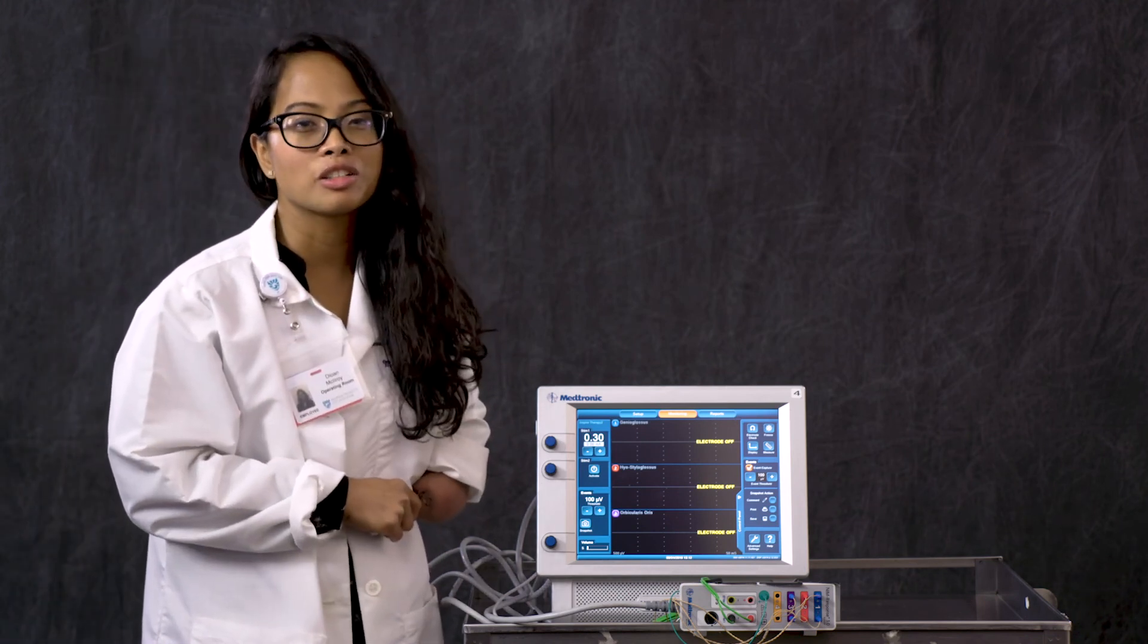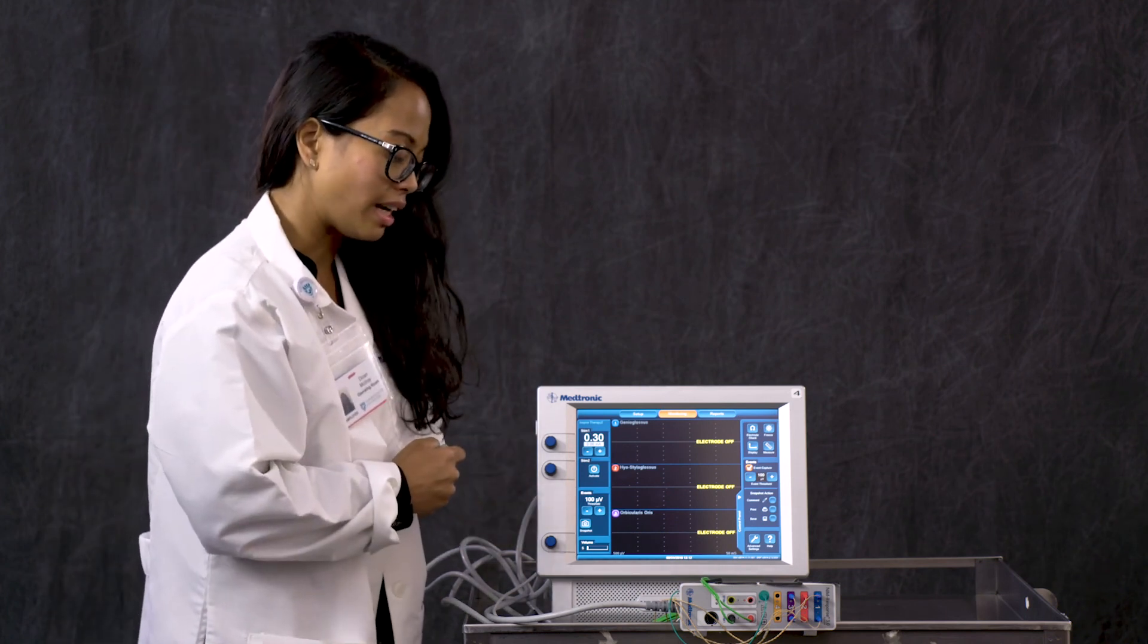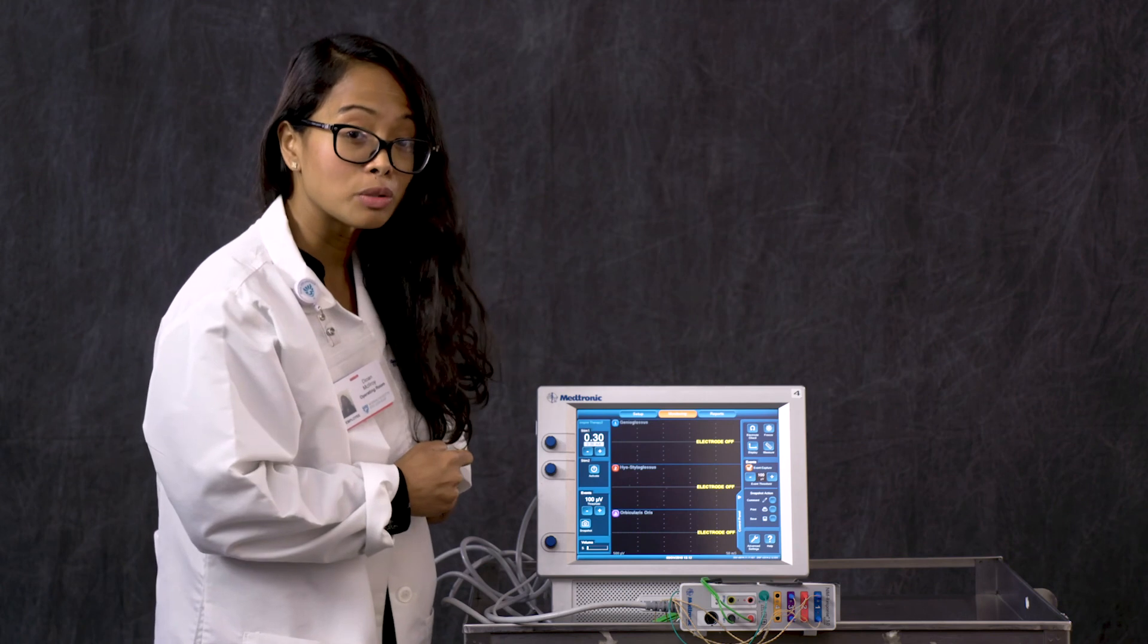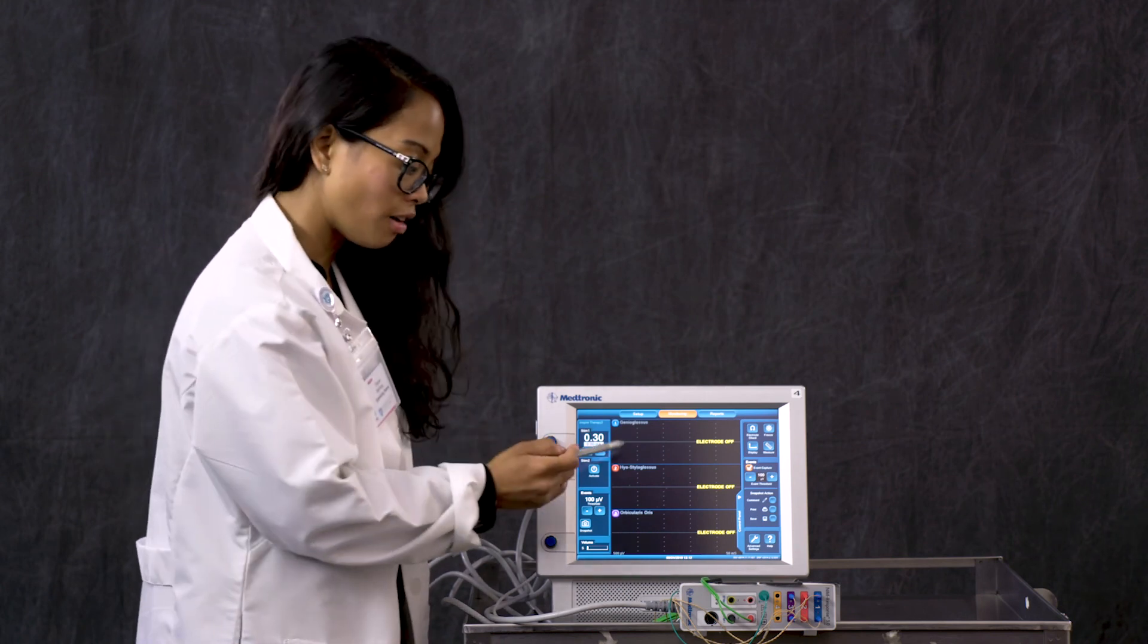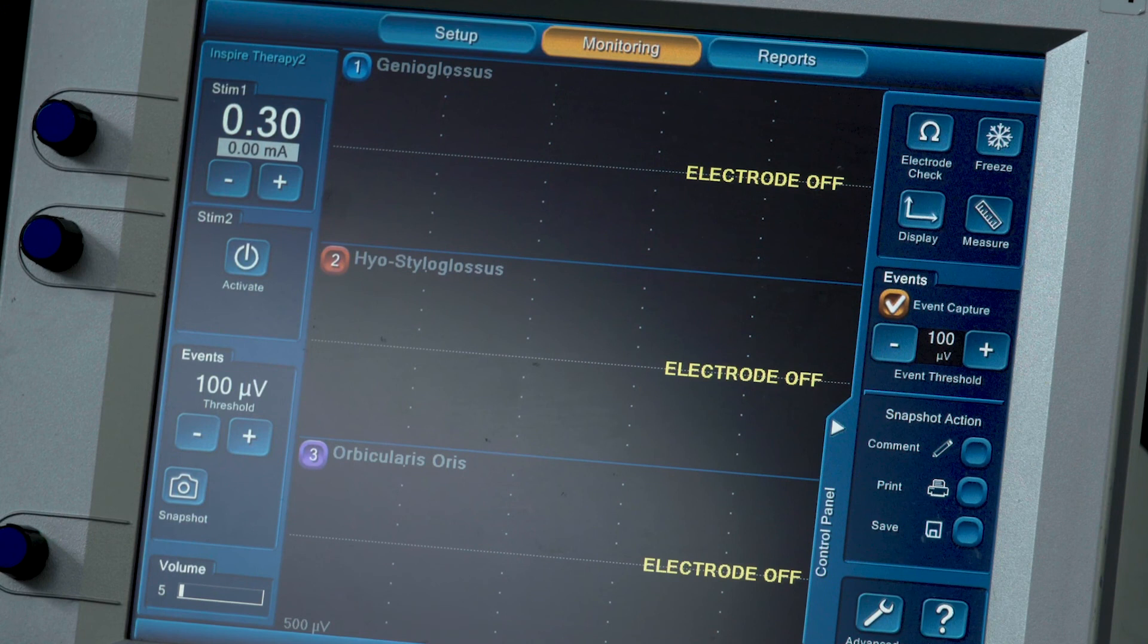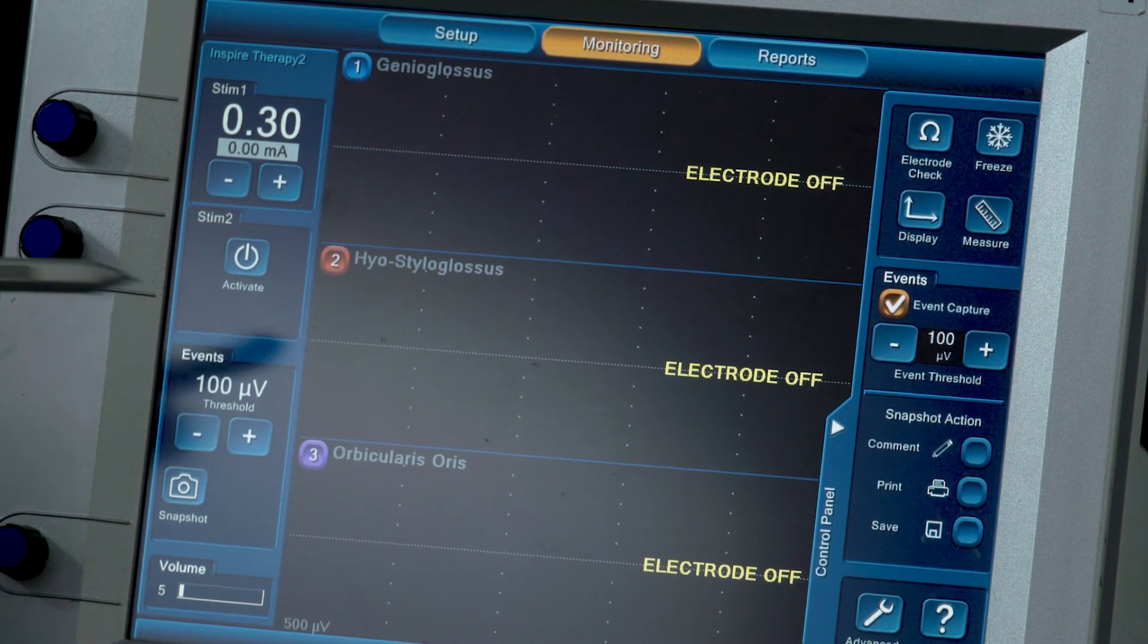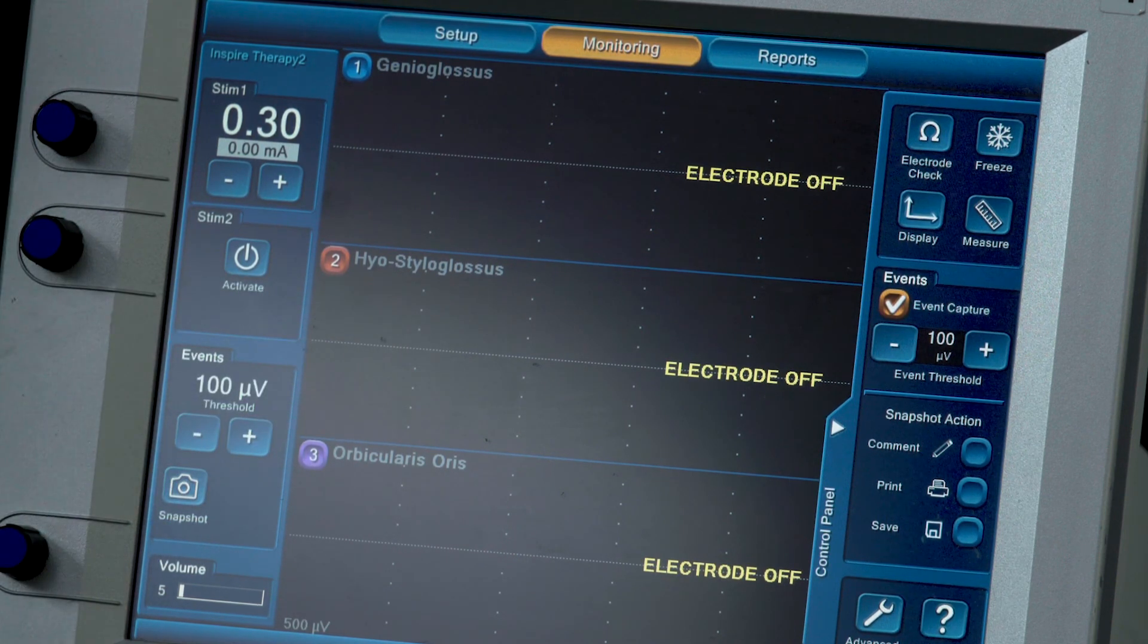So here we are on our main monitoring screen. When we are actually in surgery intraoperatively, what we are looking for, as we have our three channels here, we want to see the most EMG activity or electromyographical activity on our genioglossus branch, which identifies the inclusion branches, and minimal activity on our hyostyloglossus channel, which are our exclusion branches.